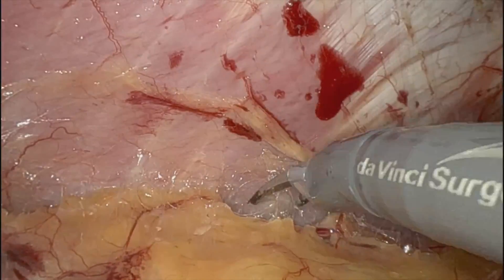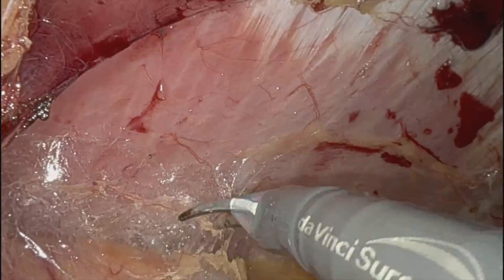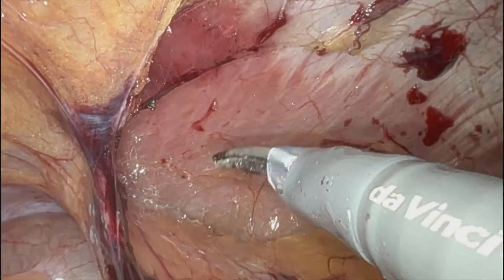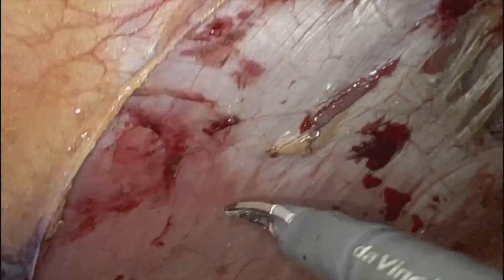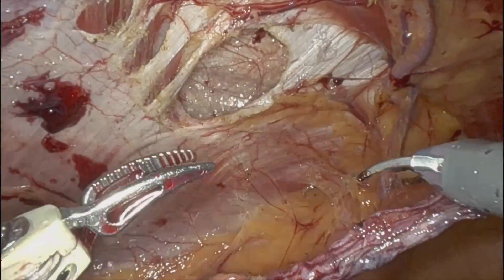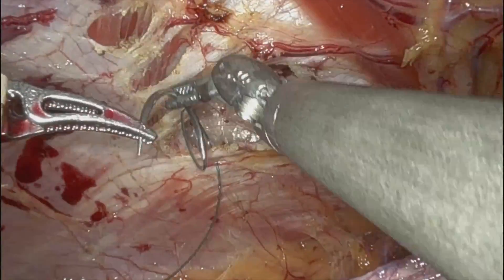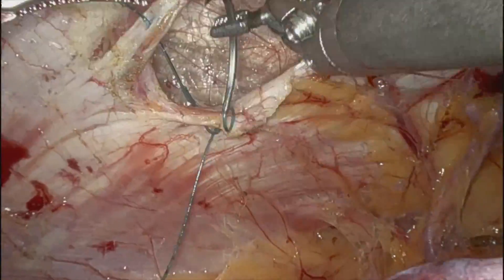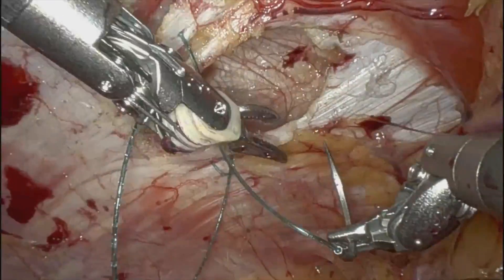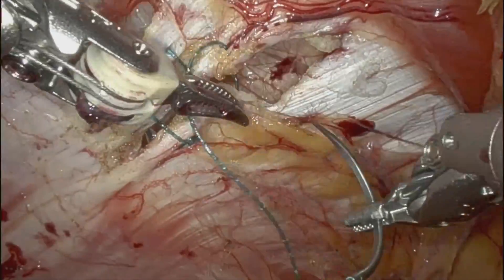Still working on this pocket, just eyeballing it to make sure that my extra-large 3D Max mesh is going to fit here. I always close the primary defects with spigelians, because the tendency here — it's not bound by anything other than the rectus and the oblique — so they tend to get larger even in the setting of mesh placement.